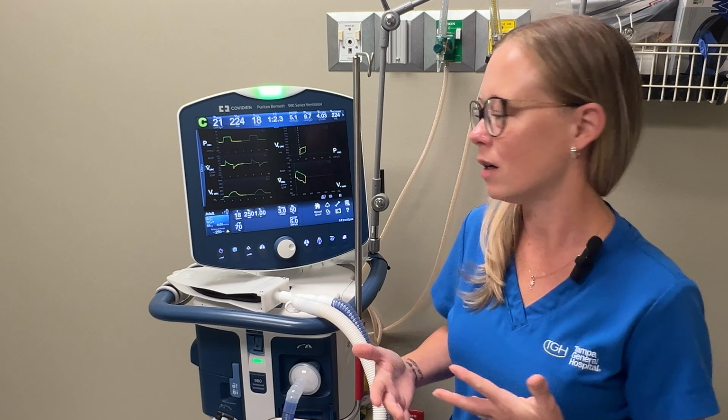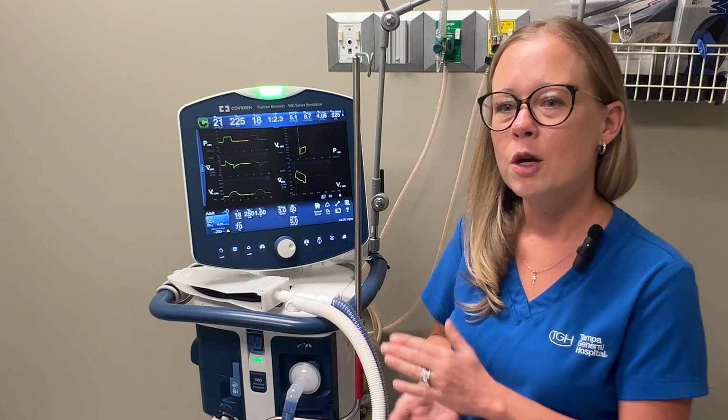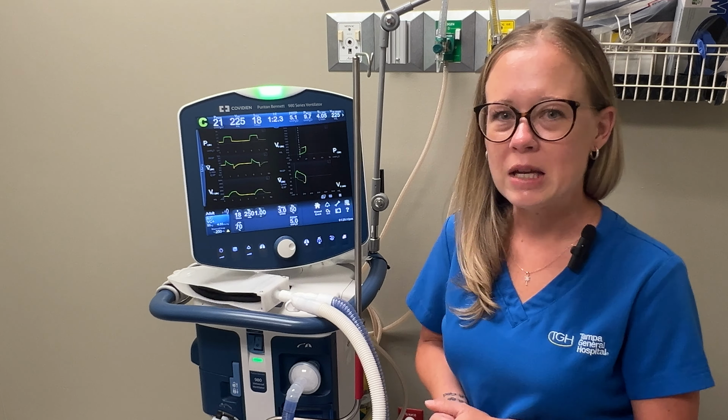This box right here is going to show you what mode the patient is being ventilated in. The ACVC means that it's an assist control mode, which means the vent is doing all of the work for the patient. Now, the patient can take breaths in between if they want to, but essentially the vent's doing all the work here. The VC means it's volume targeted, and the plus basically means that the entire tidal volume is getting delivered to the patient at the lowest possible pressure. It's a lung protective strategy.